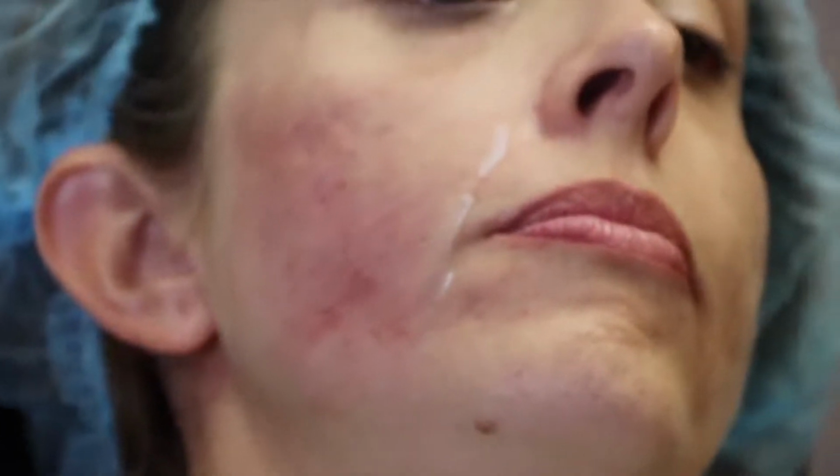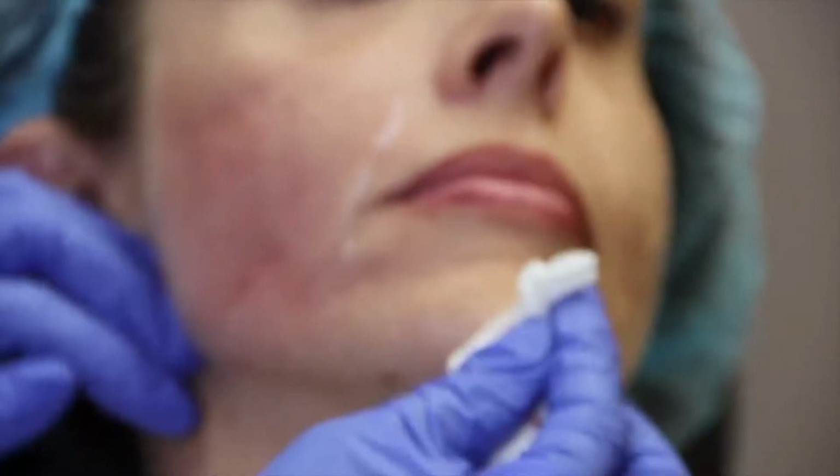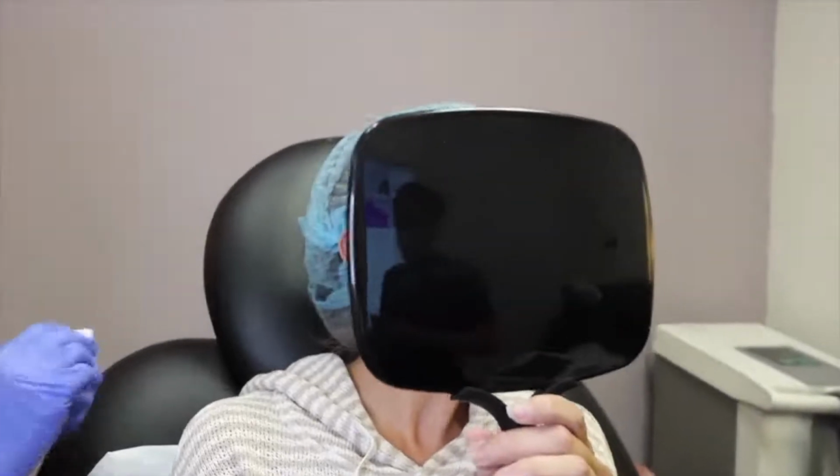That's the mirror. Can we get the mirror, please? Let me erase this now. Oh yeah. Right? Yeah, it already looks better. You see a difference? Color. And smile. See? Yeah. And so I'll put the RHA 2 around here and then more superficial there, okay? All right, and then we'll be finished. Okay. Easy? How was it? Mm-hmm. All right, good. So now I'm going to switch to the RHA 2.